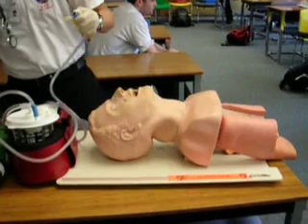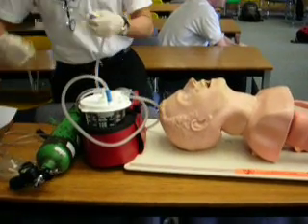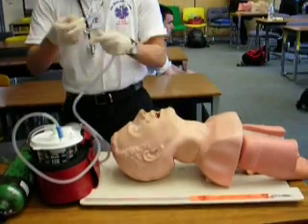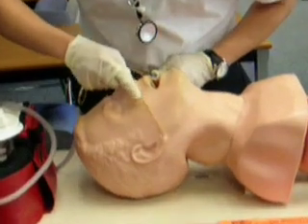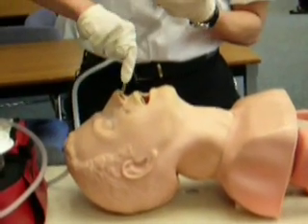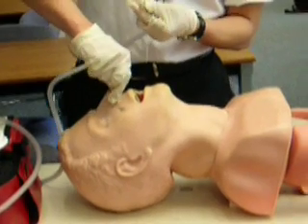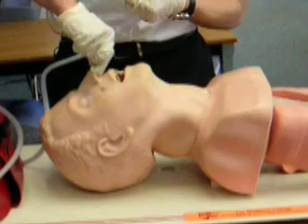From here, I'm going to put on the soft tip. I measure with one hand from the nose to the earlobe. I put it in without suctioning, then suction on my way out. Other side — suction on my way out.